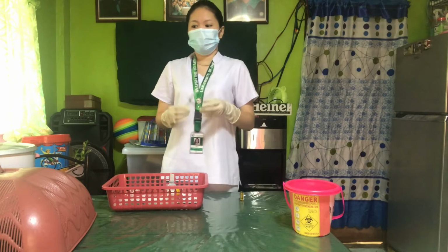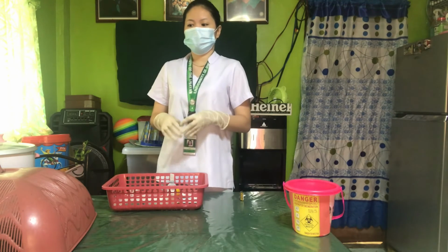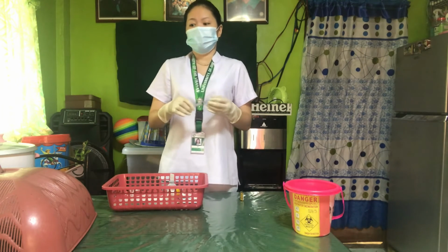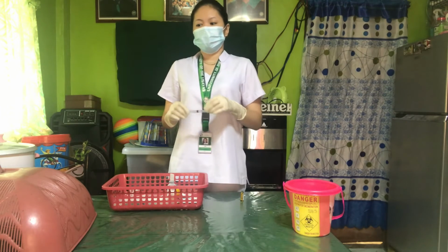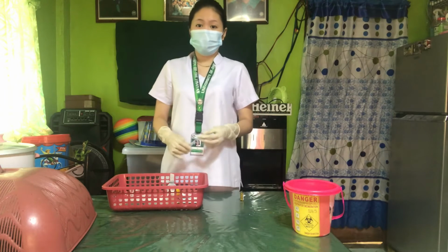So we are going to keep this tuberculin needle with the medication inside the plastic, and we are going to administer and remove this only on the bedside table of the patient. We are going to place it in the tray to make sure it is free from contamination.